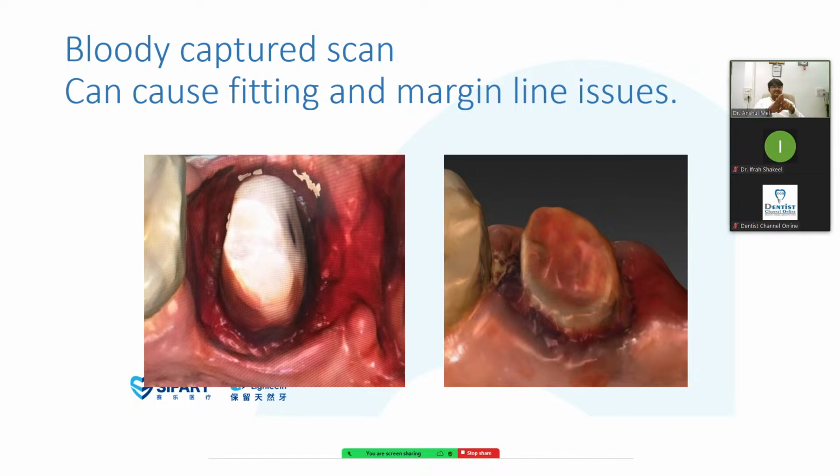A piece of gauze, because we don't want the threads. Most doctors cut a small gauze piece to stop the bleeding on a particular area. If I use the same, the threads will be inside the mouth and will interfere in my scanning. So that's why I need a long, complete palm-shaped one, the longer one. You cut it off from your gauze roll, and then you can place it.